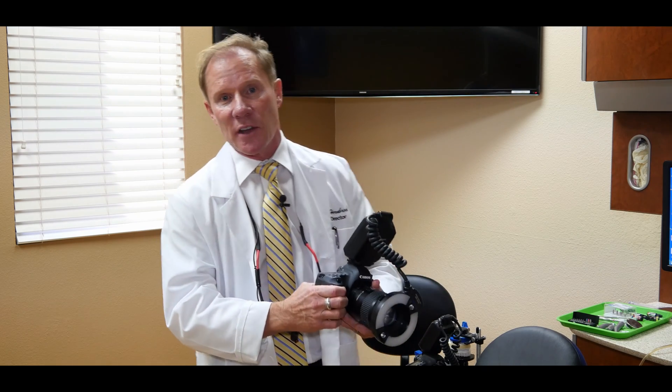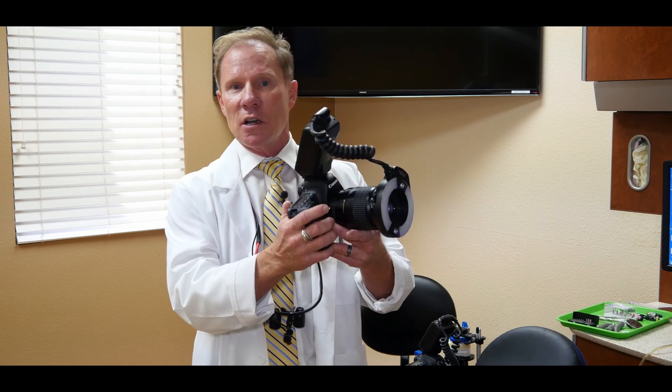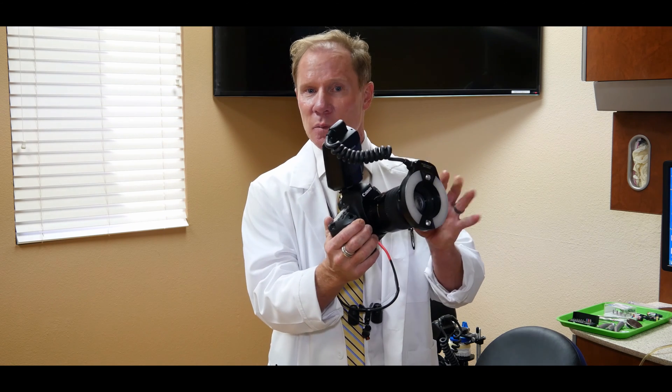I think all of us should have a really great 35 millimeter SLR digital camera. We have basically two options, and I mentioned this in another video I have available on actually taking the shots. One is a ring flash. I personally like Canon — I'd recommend a Canon body and a hundred millimeter macro lens.